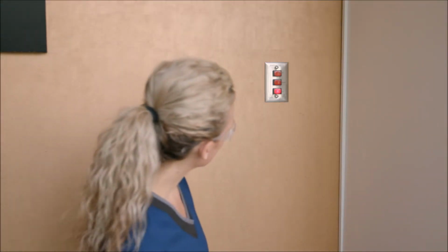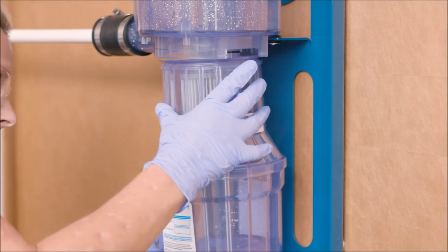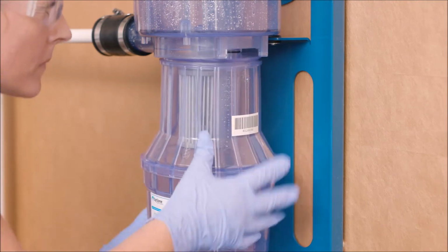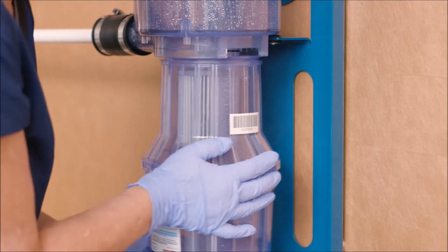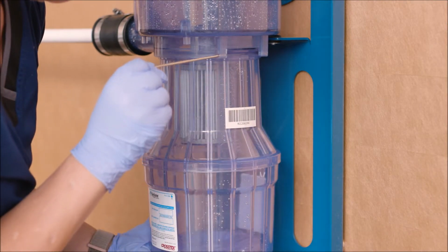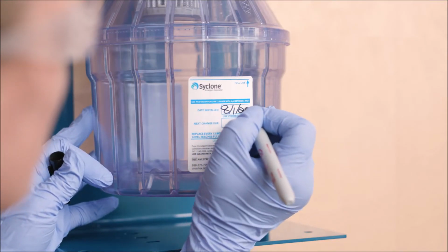Install the new canister with the vacuum system still running. The canister can only be installed one way. Rocking the canister slightly, gently insert the fittings into the receiver holes of the top chamber. Continue to push the canister into the top chamber until it is fully seated. Reinsert the retaining pins and write the installation date directly on the canister label.